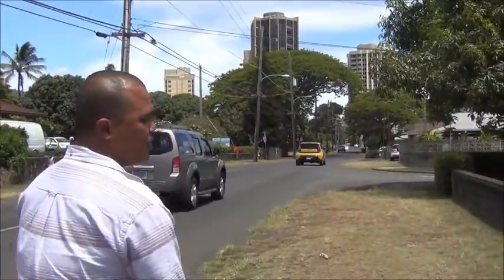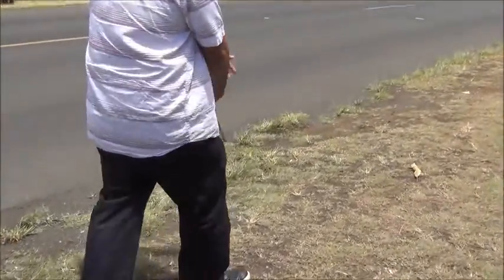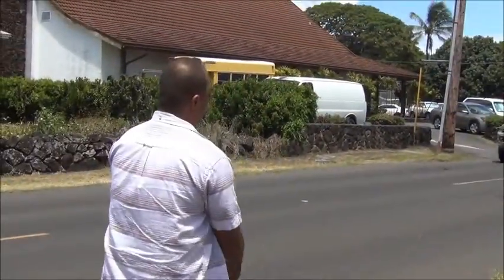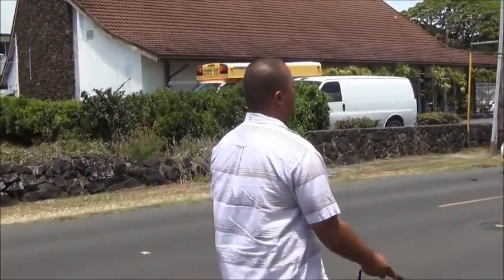Okay. There's an opening here, there's a driveway, so I'll get across the driveway. Follow my grass again. Street on my left with the traffic and continue.